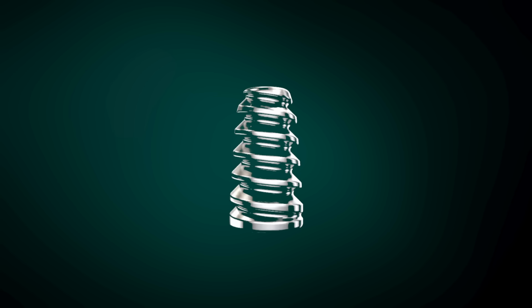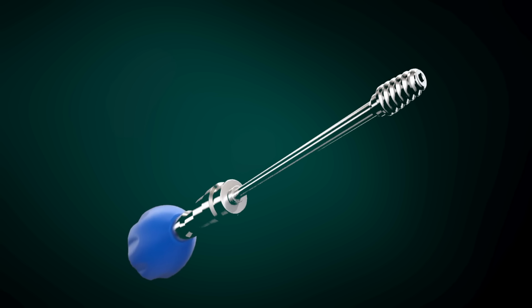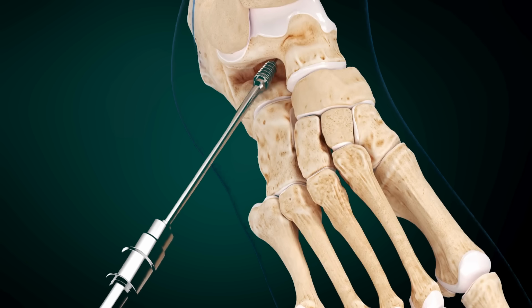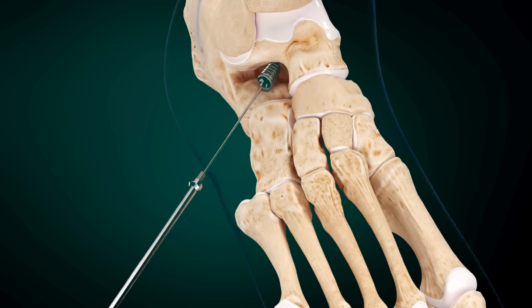After the appropriate implant size has been assessed, the respective sized implant is loaded on the driver. The implant is inserted in the same fashion as the trial sizers. Keeping the foot everted while disengaging the screwdriver helps to prevent unintentional pull-out while removing the driver.